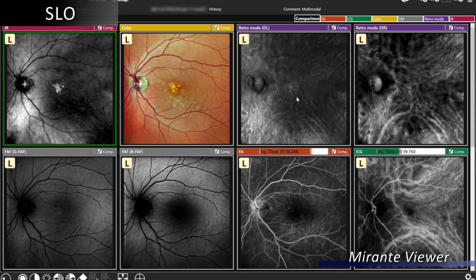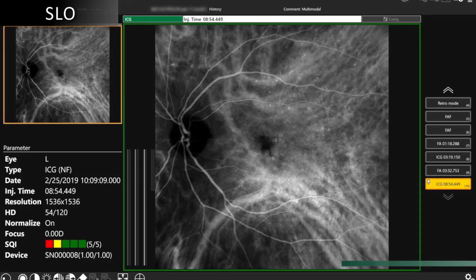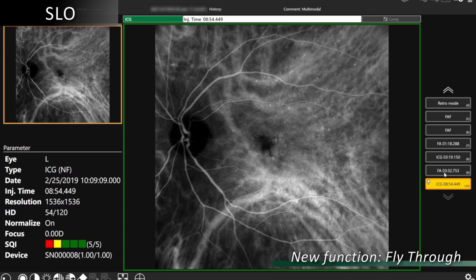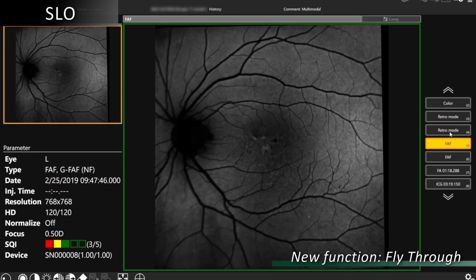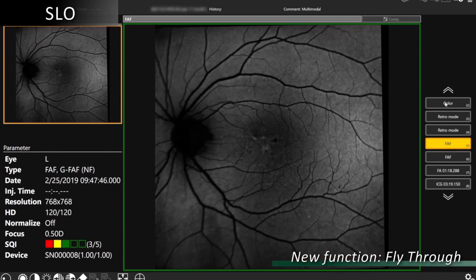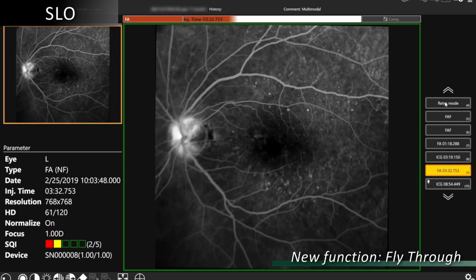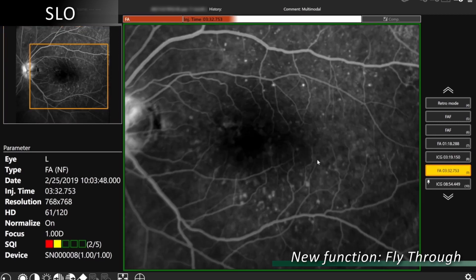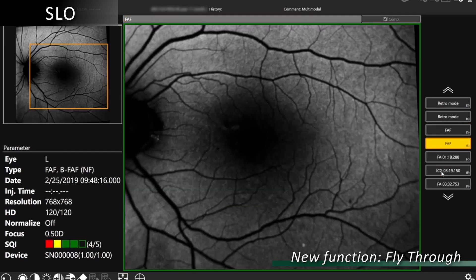As you can see, we can look at different types of modalities in comparison — all of our modalities from infrared, color, retro mode — and these can be placed side by side. Or we can select our fly-through modality, which really further enhances multimodal imaging. We can register and synchronize different modalities and fly through them one by one in the same area, or zoom in and look at the same lesion area by scrolling through all the modalities.